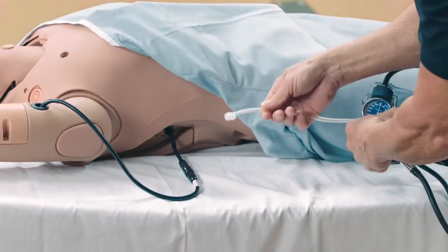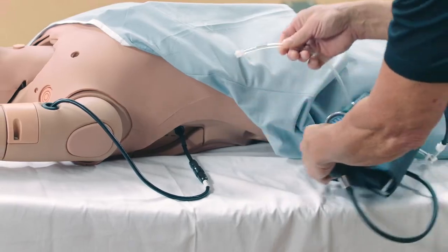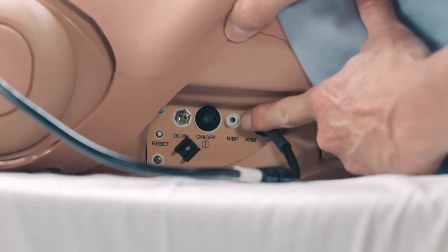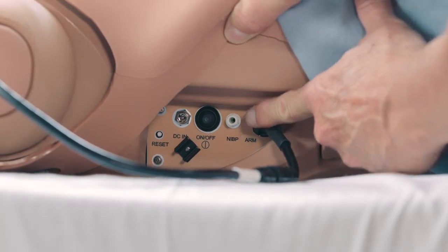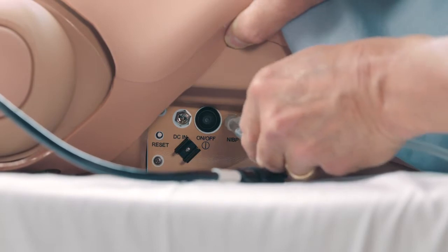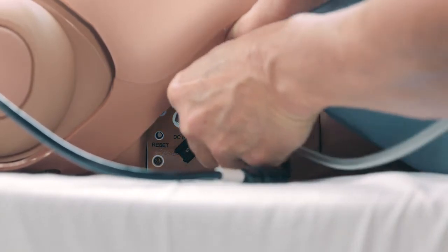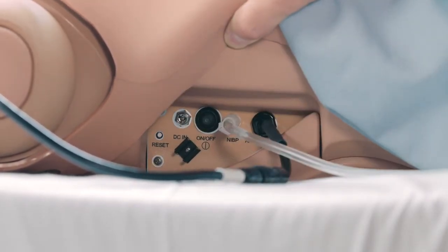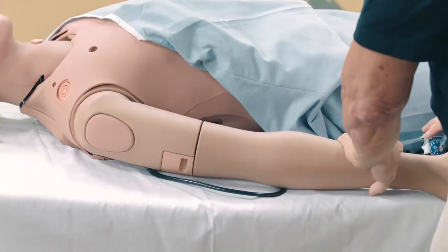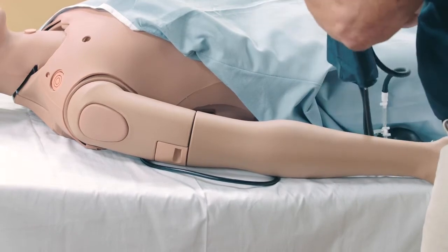Connect the extension from the long end of the T-shaped blood pressure adapter to the NIBP port on the simulator. Attach the blood pressure cuff to the mannequin's arm.